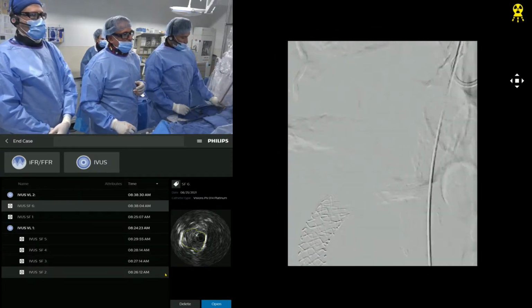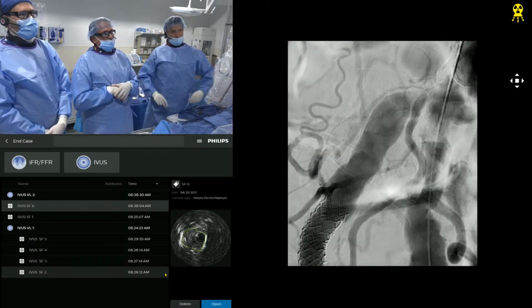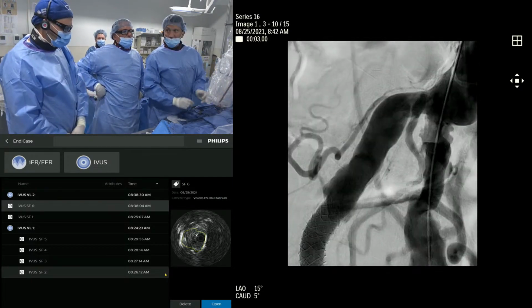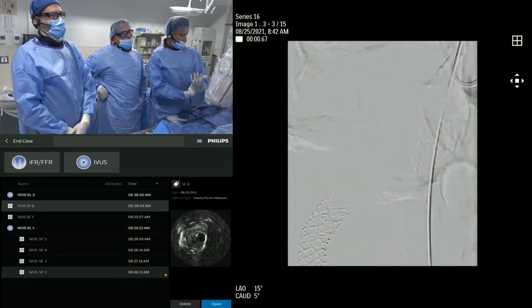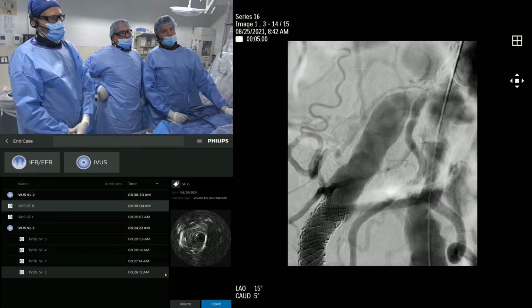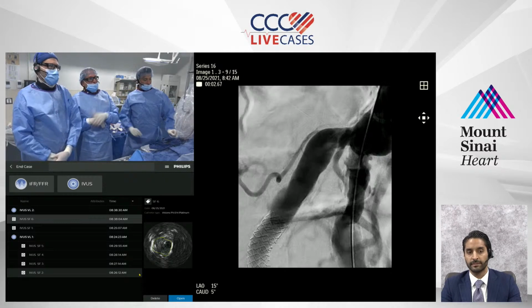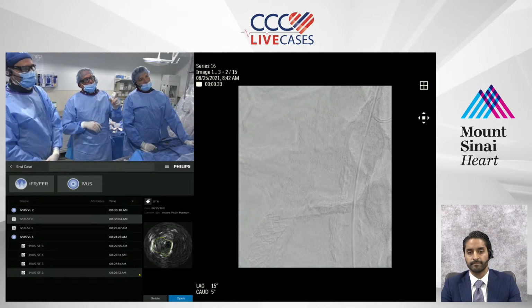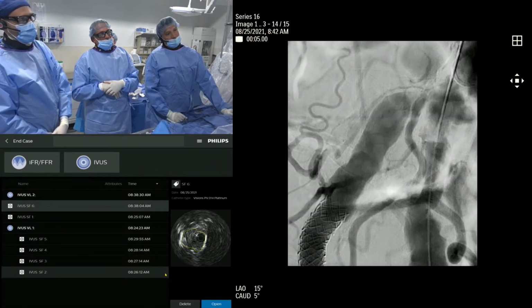One is obviously you're able to nail the ostium very well, and you can see here you have a nice view. But the question is, in theory, in order to cover the ostium, you're going to have to have one strut outside, right? Right. So the issue here is whether you go ahead and land it ipsilaterally, because you do have a nice angle, but you don't have a nice landing zone. The advantage of having it looks to be in the aorta. The aorta is fine though, because the aorta is huge. But you could see here that if we do go with the balloon expandable stent, you may pinch the contralateral side.